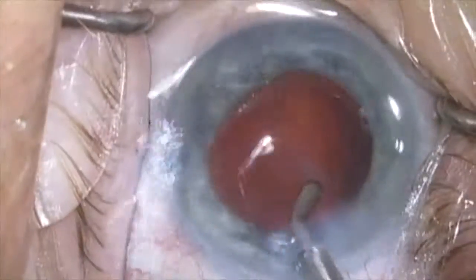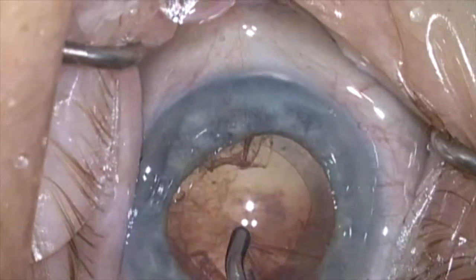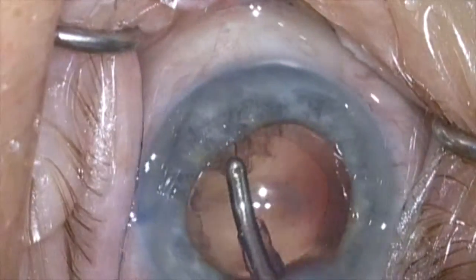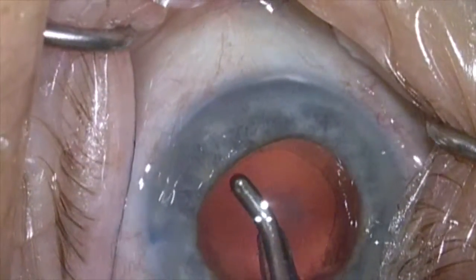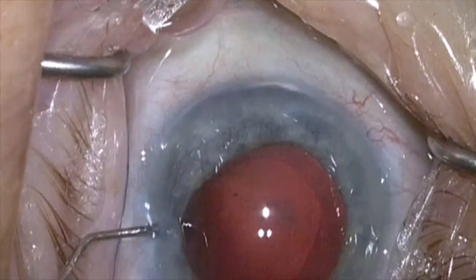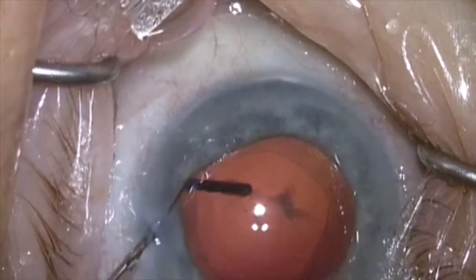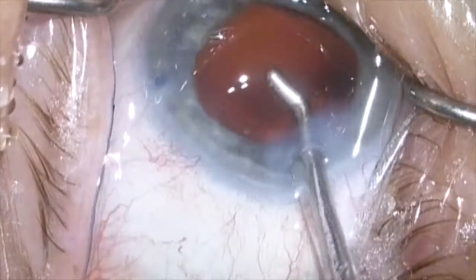Now we'll do the irrigation and aspiration of the cortex. I'm using a handpiece with a silicone sleeve that gives very nice chamber maintenance. This is fairly routine at this point, but there is a bit of tenacious central cortical plaque adherent to the posterior capsule. I'm going to try to irrigate this off the posterior capsule to loosen it up, and then go back and peel it off with the irrigation and aspiration handpiece.